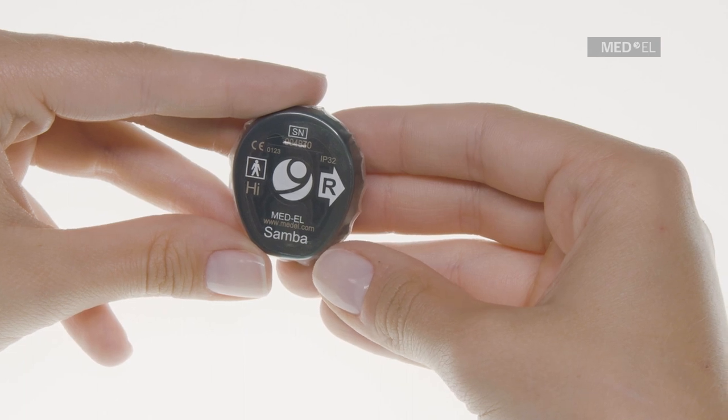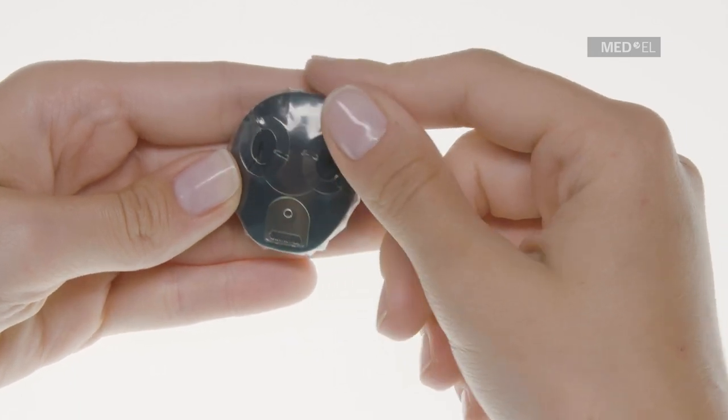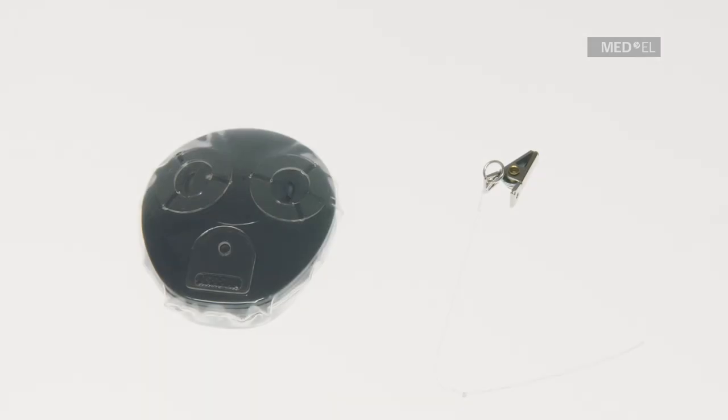To provide protection against water, the adhesive seal tape must completely adhere to all edges of Waterwear. Make sure that Waterwear was not damaged during the application.